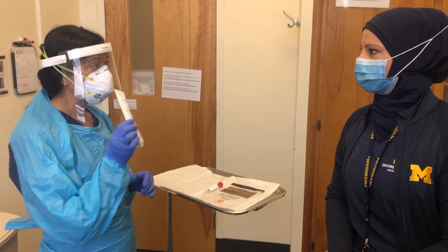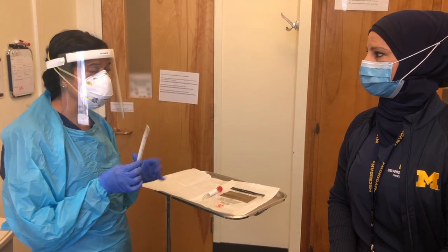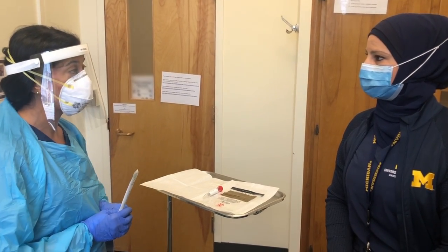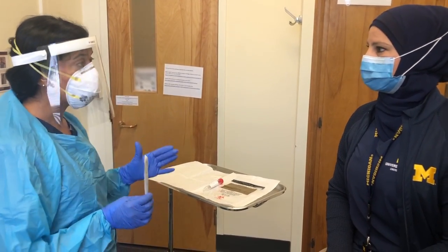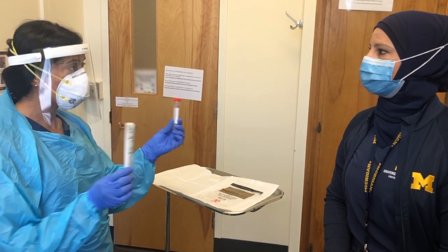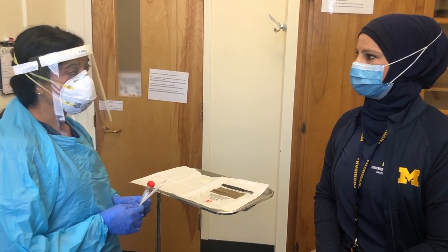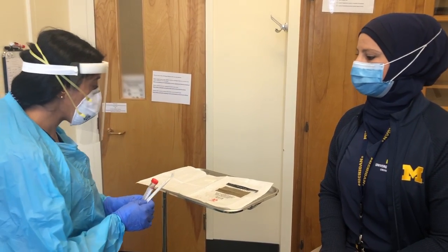Once you're there, you're going to rotate this several times for about 15 seconds or 4 to 5 rotations before removing it and repeating the same process on the other side. When you're done, I'm going to give you instructions on how to put it back into your bottle, which you'll be holding, cap it, and put it into the bag. Okay. Do you have any questions? No. Okay, let's get started.